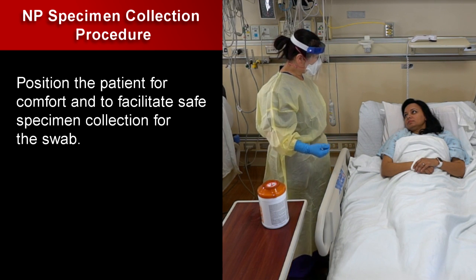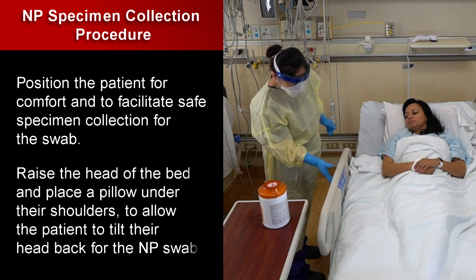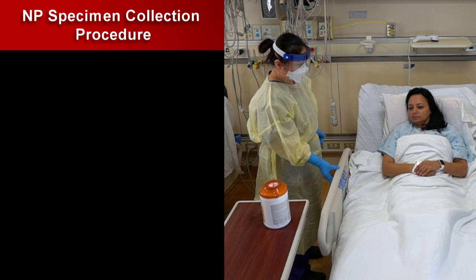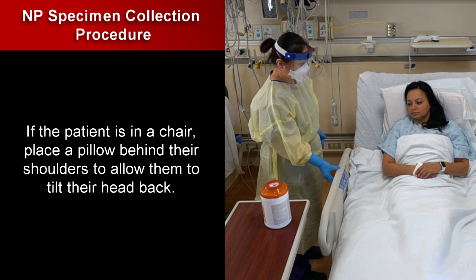Position the patient for comfort and to facilitate safe specimen collection for the swab. Raise the head of the bed and place a pillow under their shoulders. This allows the patient to tilt their head back for the NP swab. If the patient is in a chair, place a pillow behind their shoulders to allow them to tilt their head back.